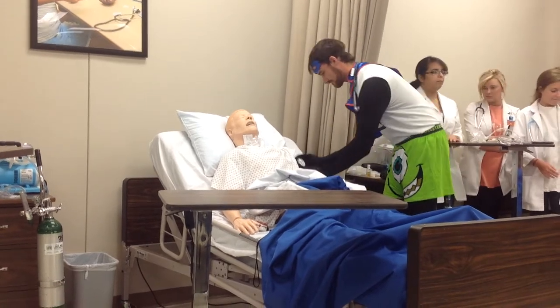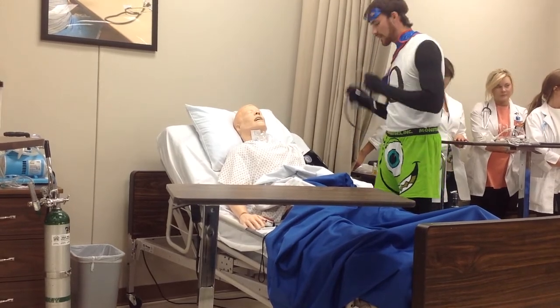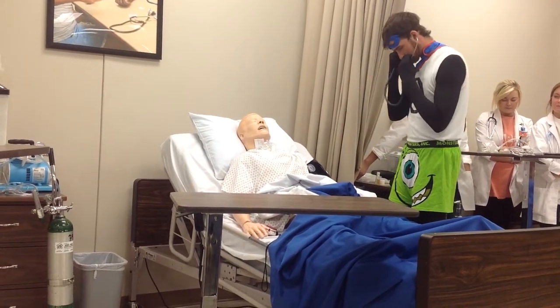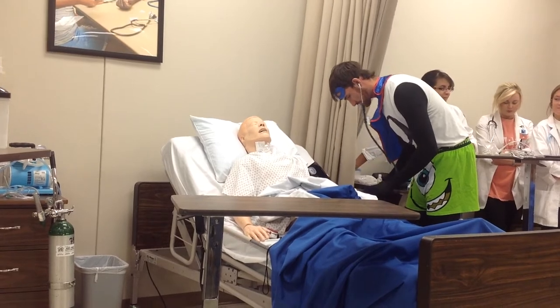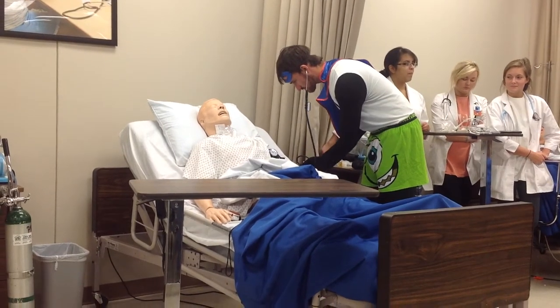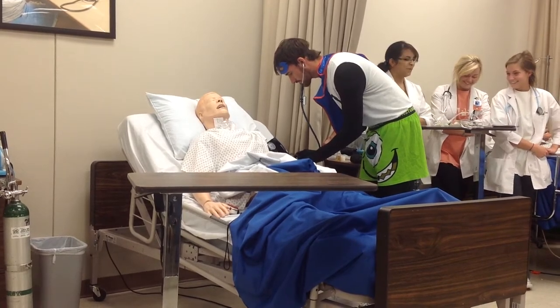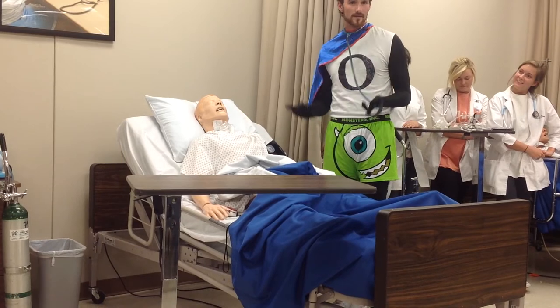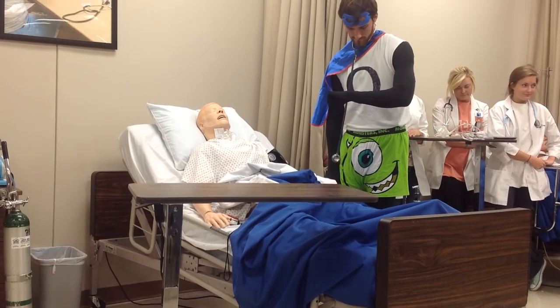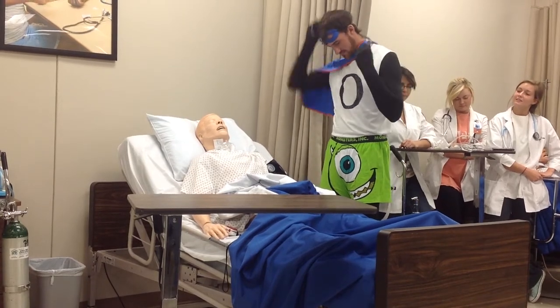Check the blood pressure. I had alcohol swabs over there, but anyway, you want to clean your stethoscope, of course. Blood pressure is 130 over 90. Okay. Can you do your pulse and stuff? Pulse is 86. Okay.